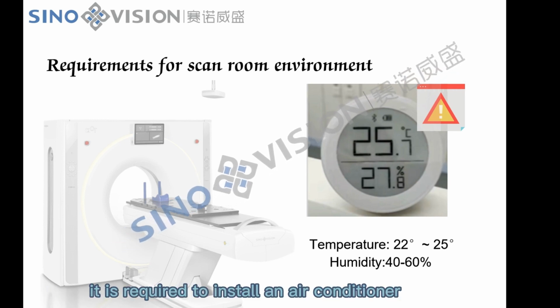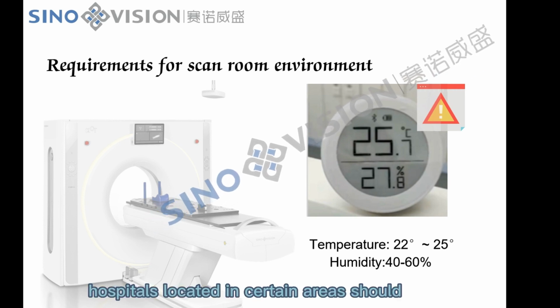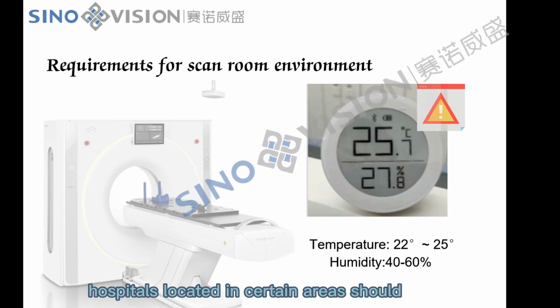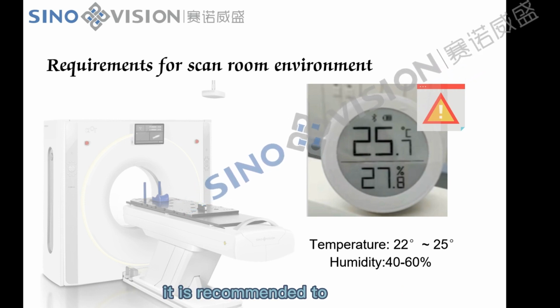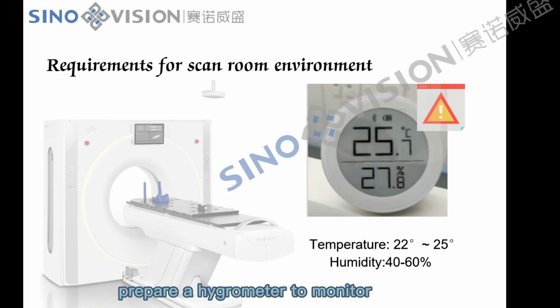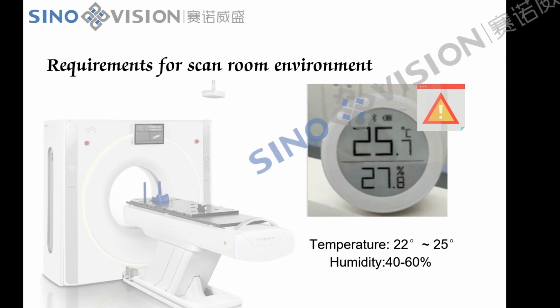It is required to install an air conditioner and maintain a constant temperature. Hospitals located in certain areas should pay attention to dehumidification and humidification. It is recommended to prepare a hygrometer to monitor the scan room environment at any time.